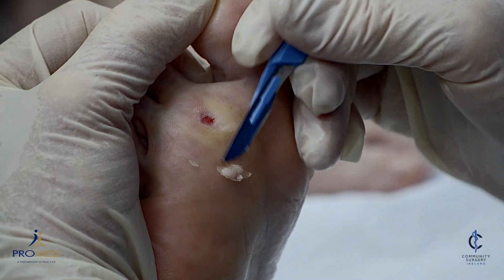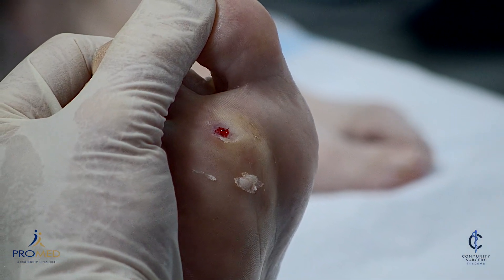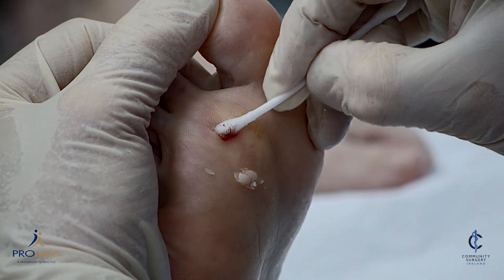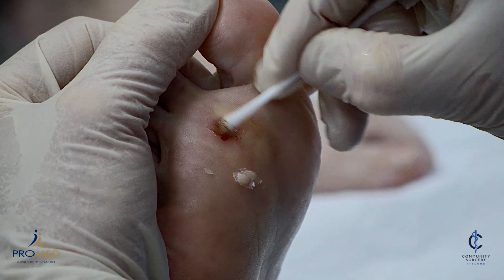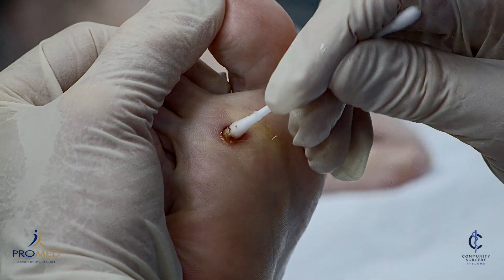So this is a combination of surgical debulking followed by cryosurgery. 20% aluminium chloride is very good for controlling bleeding. Sometimes they bleed a lot more than what you're seeing here, but the smallest drop of that usually stops the bleeding. And then it's ready to freeze.